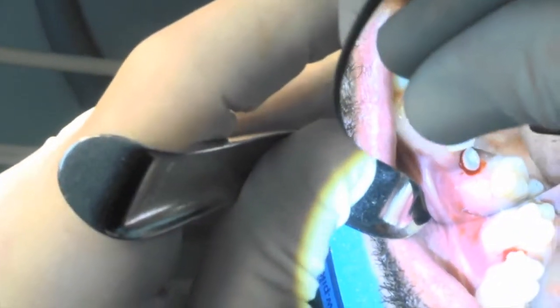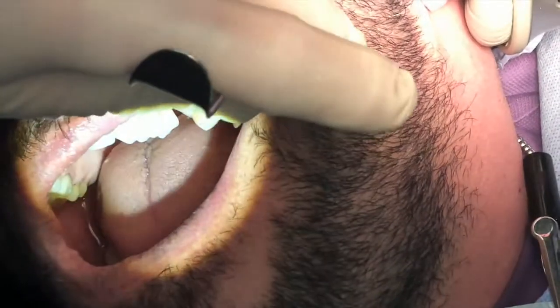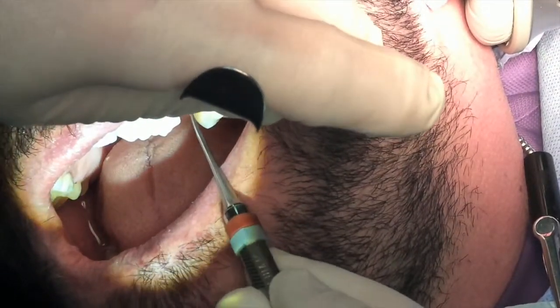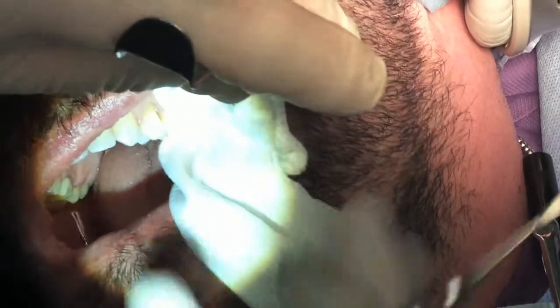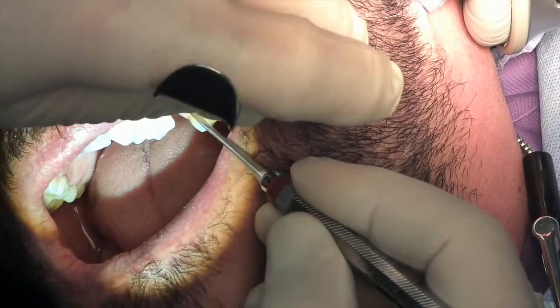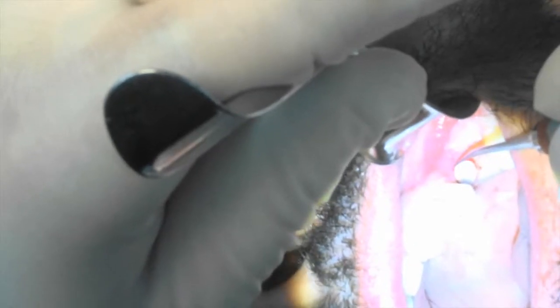Okay. Now, once again, this can be prepped at any point in time. I can come back in here and easily prep this. The level of the bone, I'm going to get a great soft tissue seal. This can be prepped down so my margin can be at the tissue level. Okay, we're at 10 millimeters. So that's a really good situation.